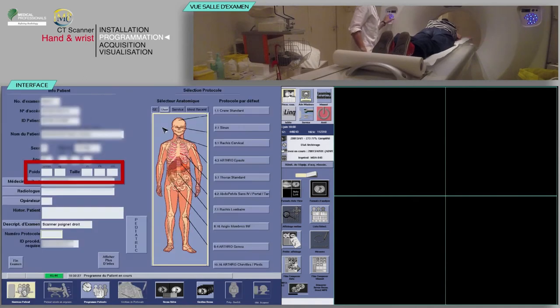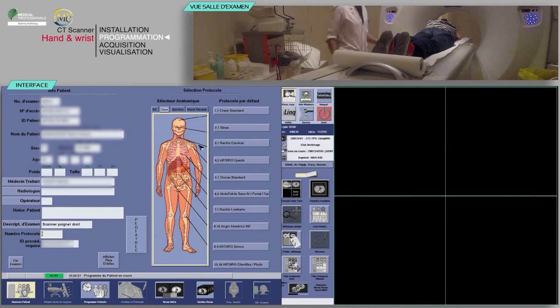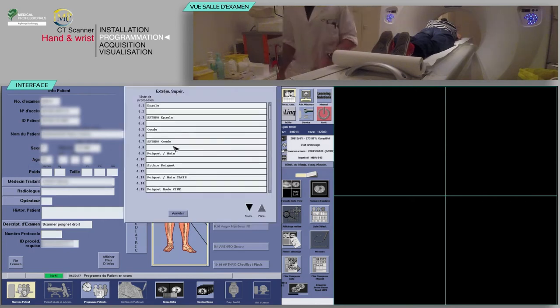Verify the pre-filled information is correct and fill in the patient's weight and height. Finally, select the appropriate protocol.